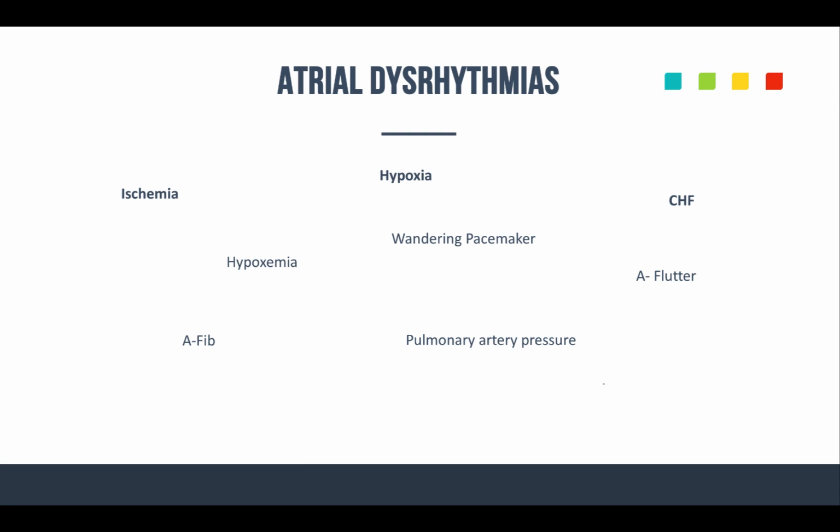Okay, and especially if you read an exam question that gives you this whole scenario, and then they show you an EKG, right? You might not think, okay, well, somebody who has a CNS trauma, let's say, is going to have a normal sinus rhythm. They might show you something else going on, so be prepared for that type of answer going forward. All right, and the same thing in the field.